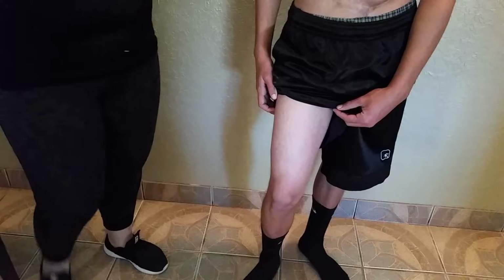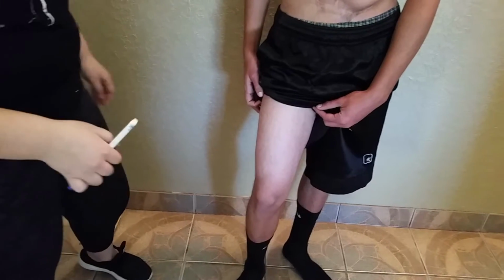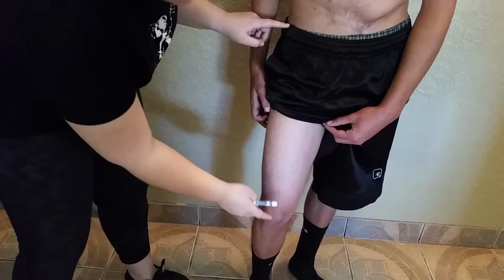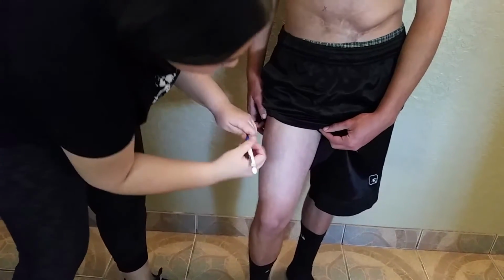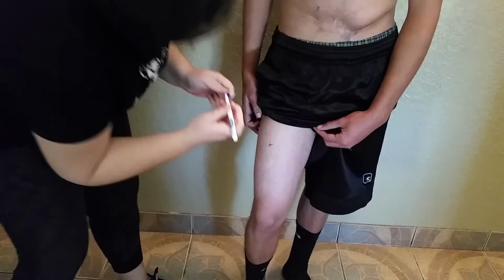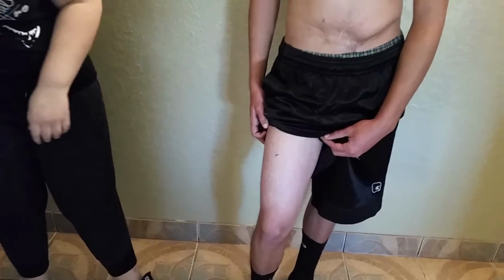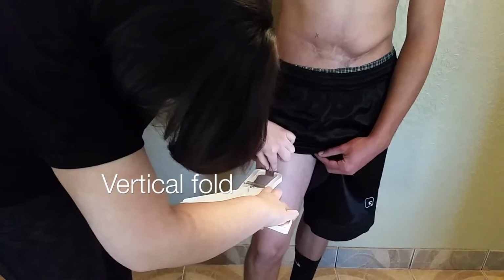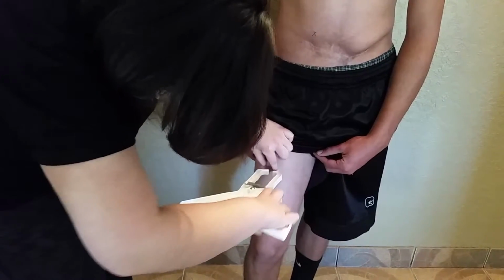For the final site, the thigh, have your client shift their weight onto their left foot. Mark your X on the anterior midline of the thigh, midway between the proximal border of the patella and the hip. Obtain a vertical fold, hold for 1 to 2 seconds, and release.